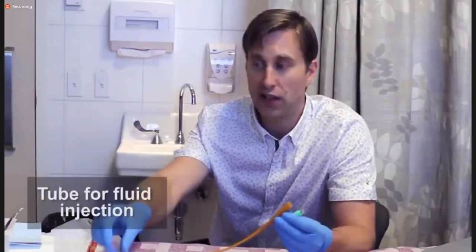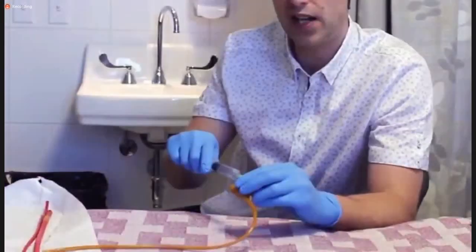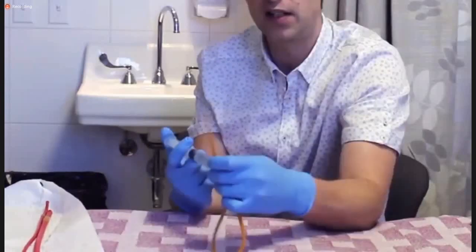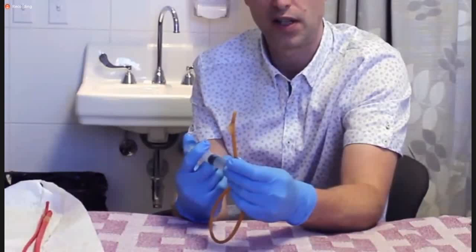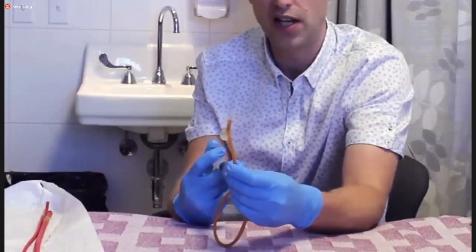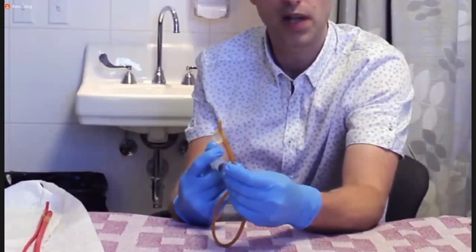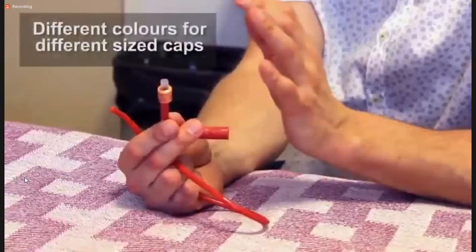catheter in place. So, just to demonstrate, if I inject a syringe with fluid or air into this catheter and you inflate it, you will start to notice that this balloon inflates. And as that balloon fills to usually about 10 cc's as a standard, this balloon is what holds the catheter in place while it's in someone's bladder. So that's the basic anatomy of a catheter. The other thing you'll notice is that caps do come in different colors, which indicates the different sizes of the catheters.